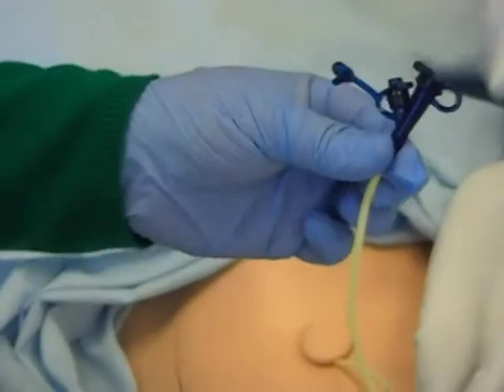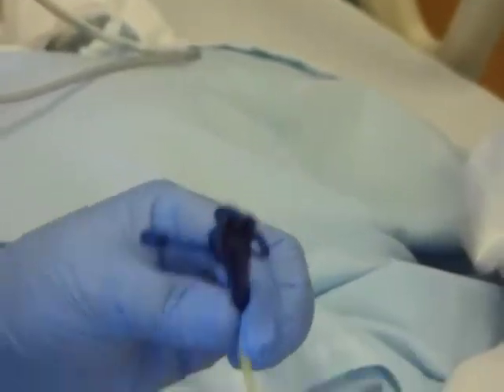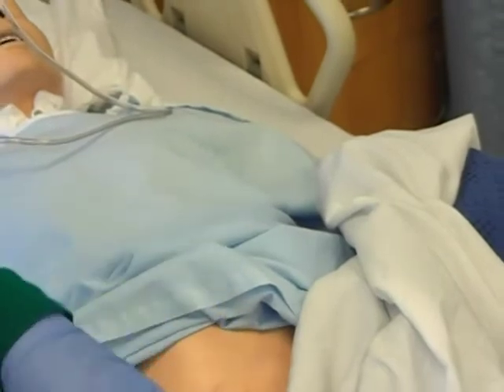One connection is for feed, and one is an air inlet. This is what we call a gastrostomy tube. Now we're going to go over to the kangaroo pump.